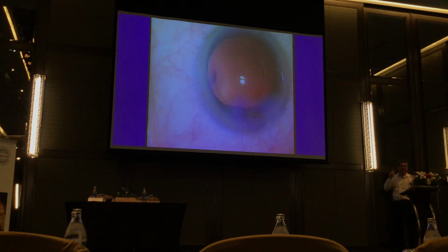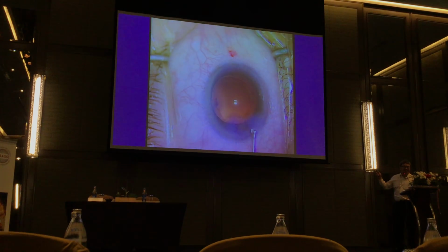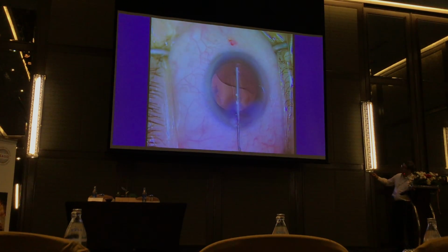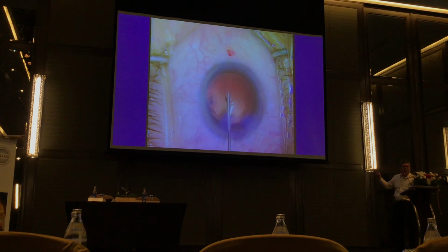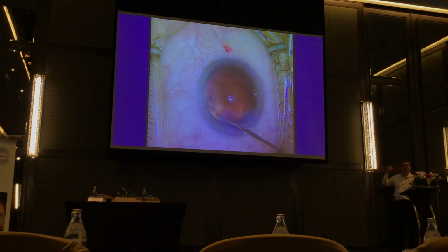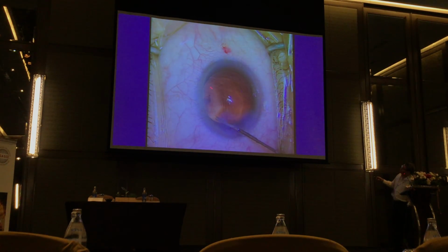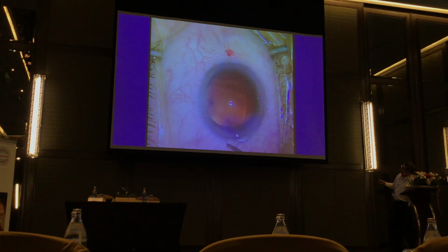This happened to me. Why? Because I was lazy. What didn't I do that I should have done? I didn't control the anterior chamber. I pulled it out and let the anterior chamber shallow, and that caused the posterior radial extension. Once that happened, you see the flaps disappeared. You no longer see the flaps once that's been done.